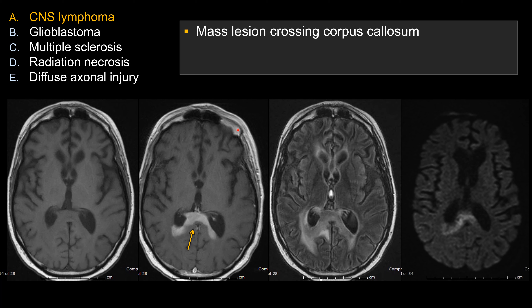The enhancement pattern here is homogeneous. The intra-axial lesion was relatively large in size without any central necrosis, especially involving the corpus callosum or central structures — I think about CNS lymphoma in an immunocompetent patient. Remember, in an immunocompromised patient, CNS lymphoma may show quite a bit of central necrosis or rim enhancement. So this homogeneous enhancement is very characteristic of CNS lymphoma in an immunocompetent patient.